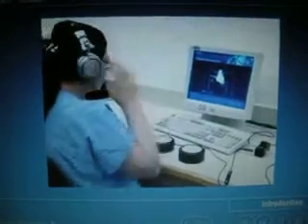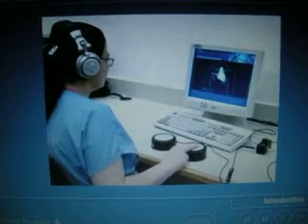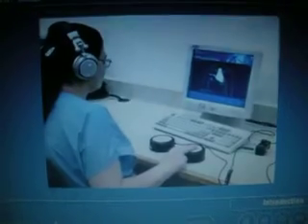Simulated heart sounds may be listened to with headphones, but the pulse must be simultaneously palpated at the pulse reproducer as if you were using your stethoscope with a patient.